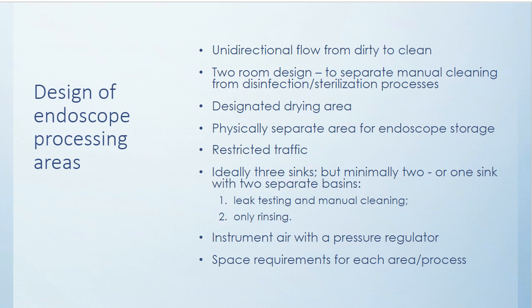Another topic that's important for endoscope processing is the design of the processing areas. Historically, endoscope processing areas have been very small and were maybe last on the list to get the space that they needed. But we truly need enough space and enough time and the proper equipment to do this right.